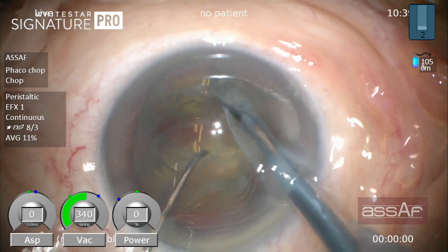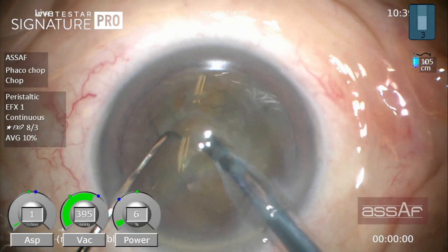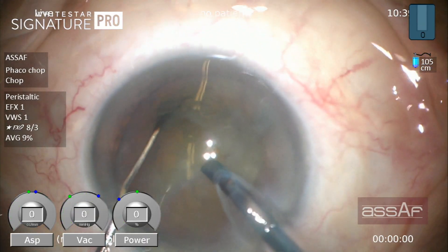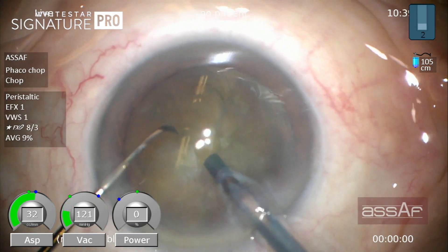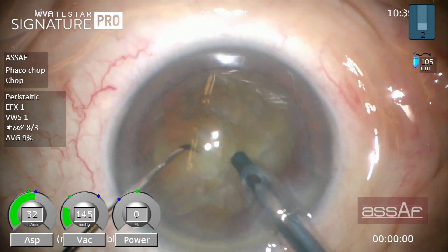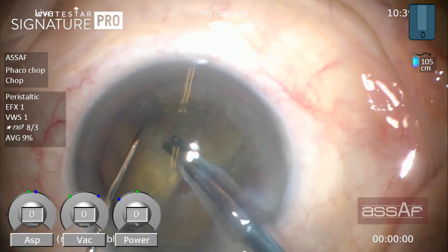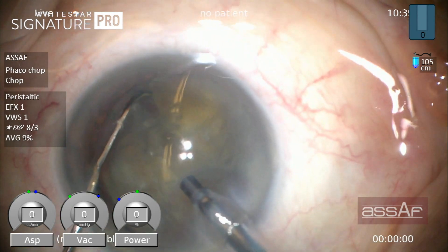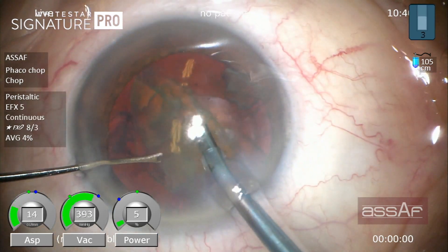How many lessons should we learn from this routine phacoemulsification case? This is a routine phacoemulsification for a nuclear grade 3 cataract, and as you can see, everything went just fine.